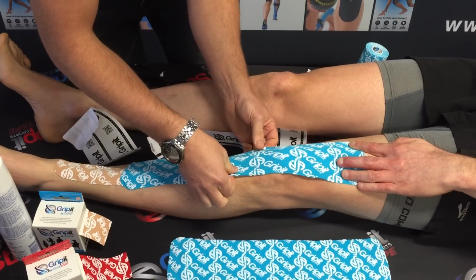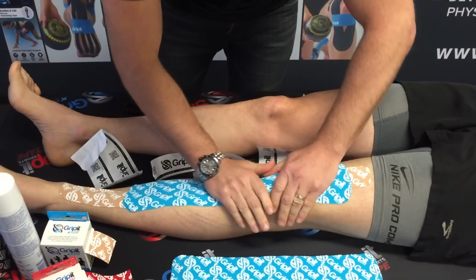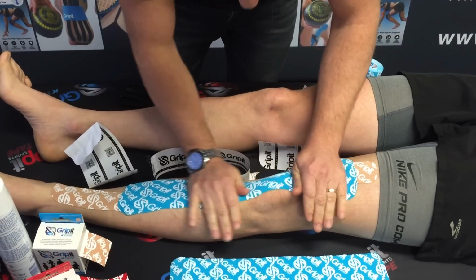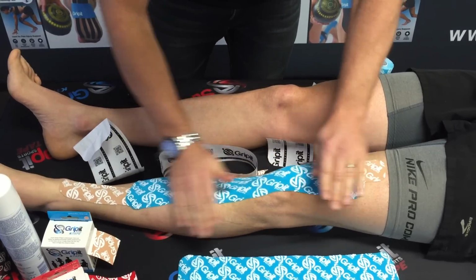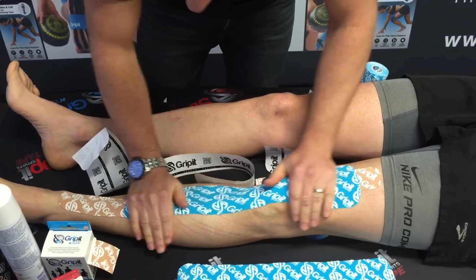So because it stretches 4 ways, it's a multi-directional stretch tape. Thanks, Danny. You can sort of stretch it out a little bit that way as well if you want to. Now the glue is acrylic, so it likes to warm up, get around that 35-degree sort of point before it really starts to stick well to the skin. So a little bit of heat activation with rubbing is great.